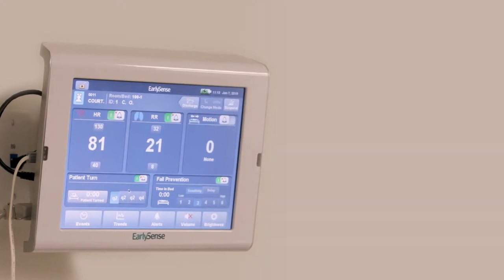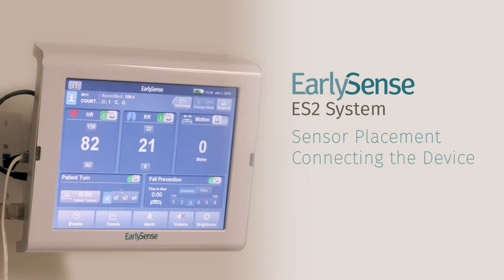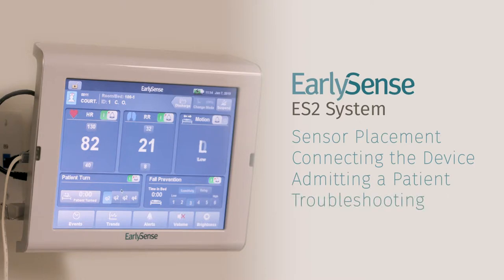Welcome to the EarlySense tutorial video. This video will cover placement of the EarlySense sensor, connecting the ES2 bedside unit, admitting a new patient, and basic troubleshooting. For additional information on how to operate the EarlySense system, please refer to the relevant user guide provided upon installation or online at EarlySense.com.